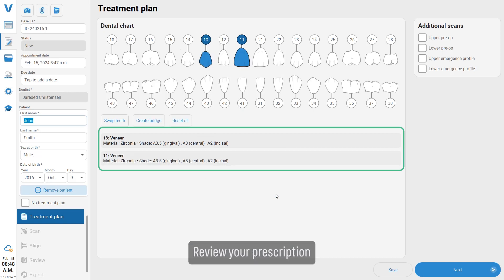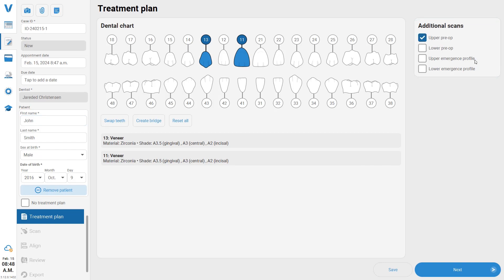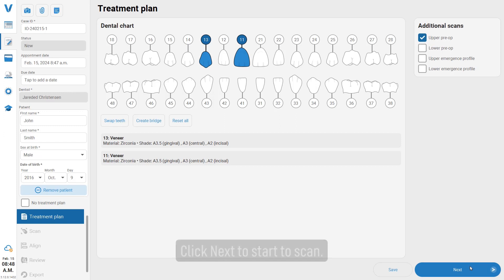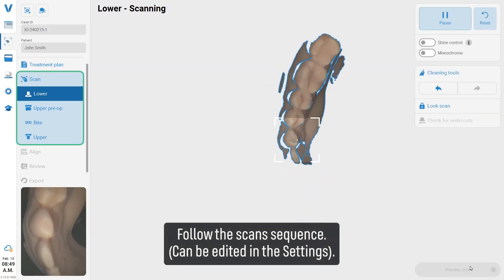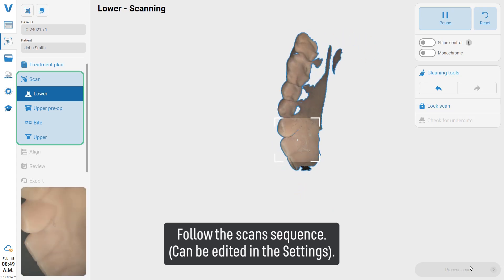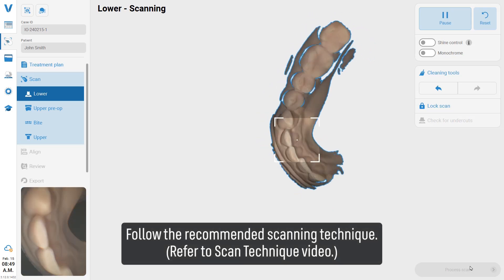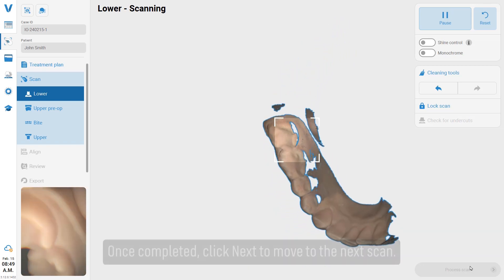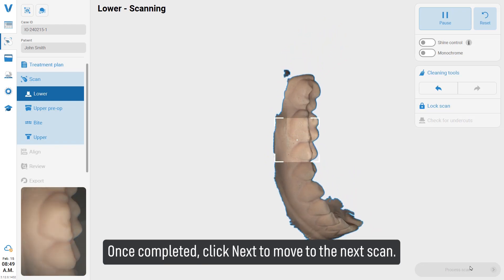Review your prescription and select the right pre-op scan. Click next to start the scan. Follow the scan sequence and the recommended scan technique. Once completed, click next to move to the next scan.